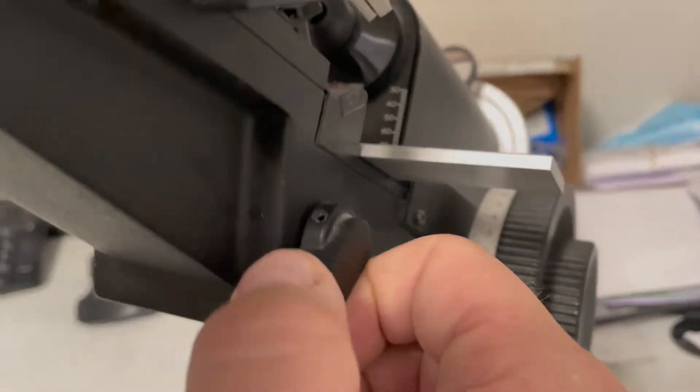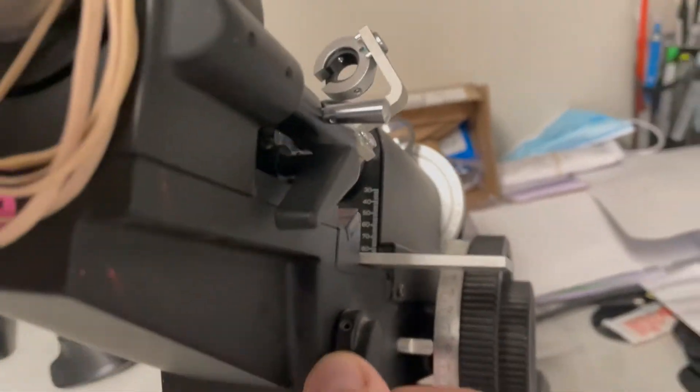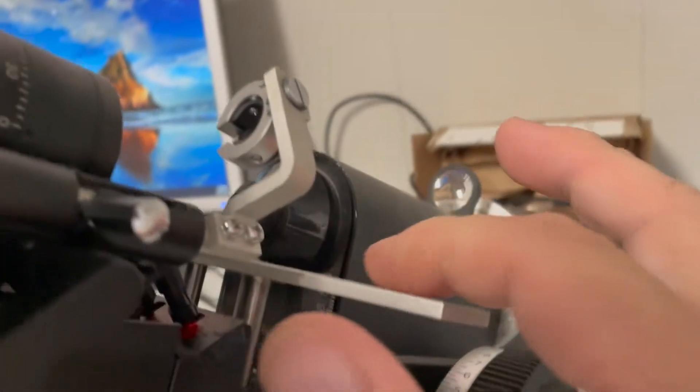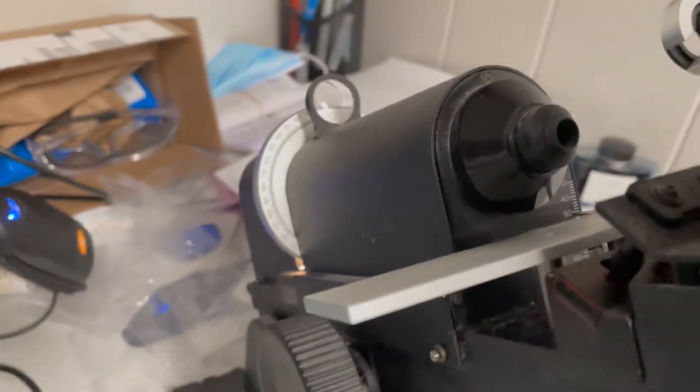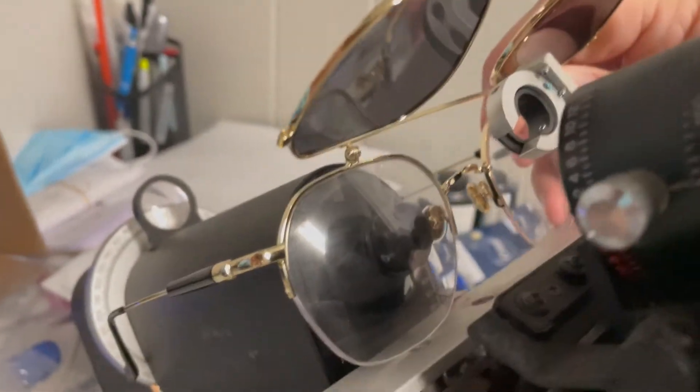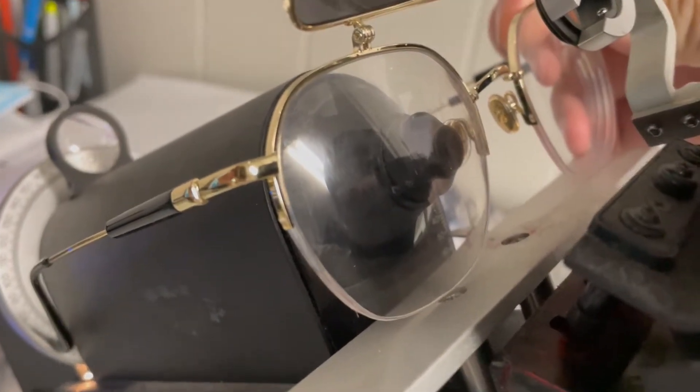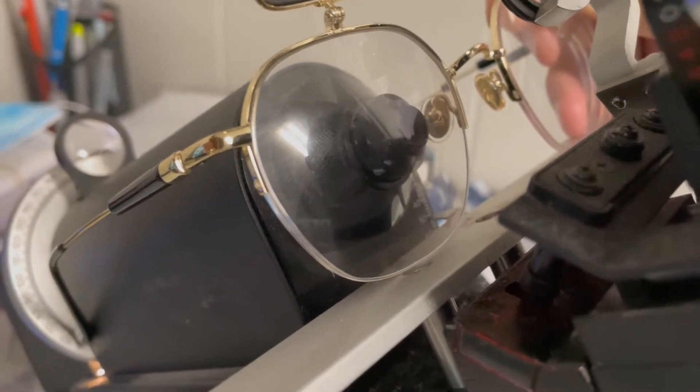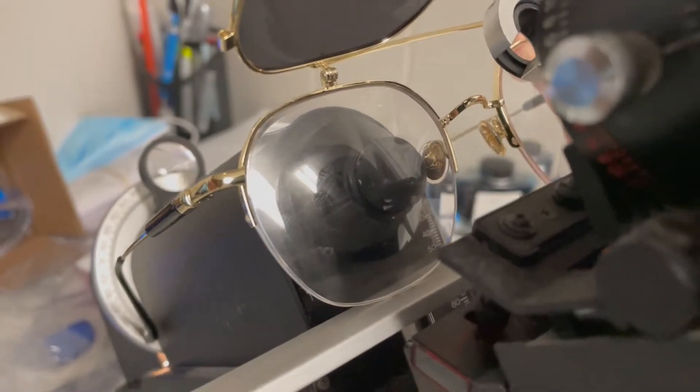Okay this lever right here raises and lowers the table and what you use this for is to put your frame on there so that way you have a nice even surface. This is not a good frame to show this but just to give an example. The idea is to have both sides of the frame touching that table so you're able to get a true 180 reference. That way when you go to check the axis you can tell whether it's on or off.